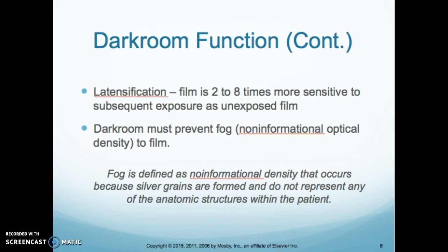So the darkroom must prevent fogging. So what's fog? Fog is density on your film that takes away your detail. We're going to talk about that once we get to film.